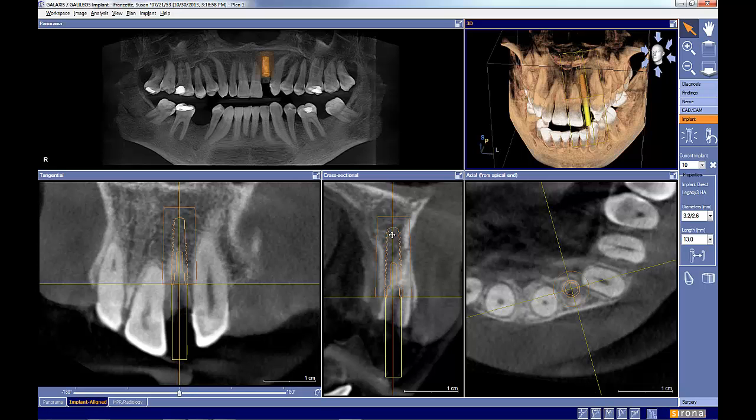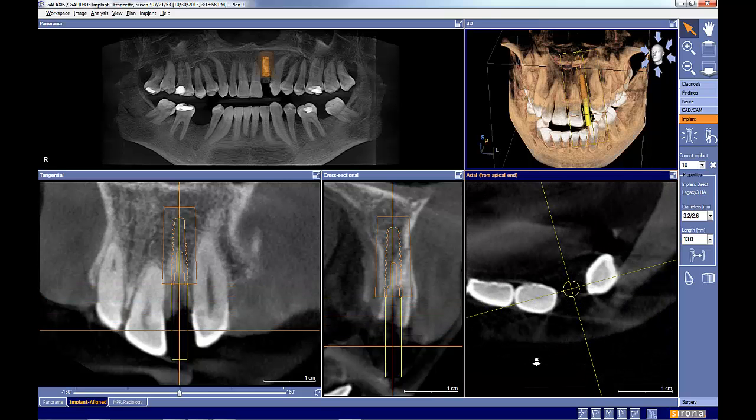My goal in this one was not to look at an implant plan because I don't like to plan anterior teeth without CEREC data to get the implant in the right position. I'm also maybe a little thin here. More I wanted to point out the area of that buccal dehiscence, potential buccal dehiscence, and how we can use the technology to better look at these things. Thank you very much.